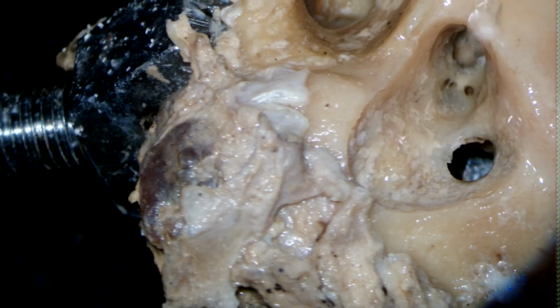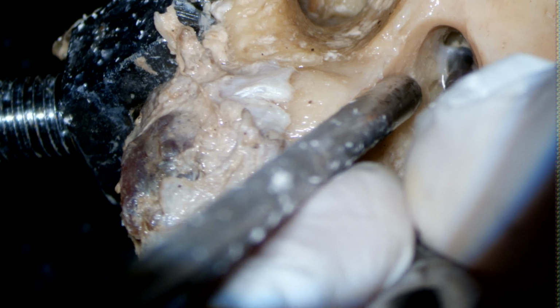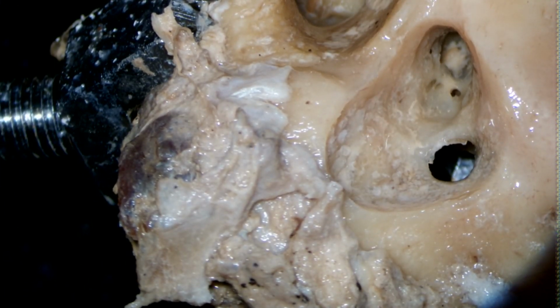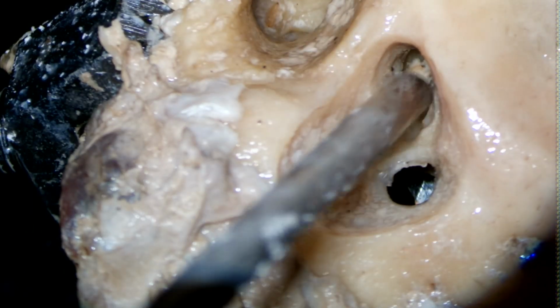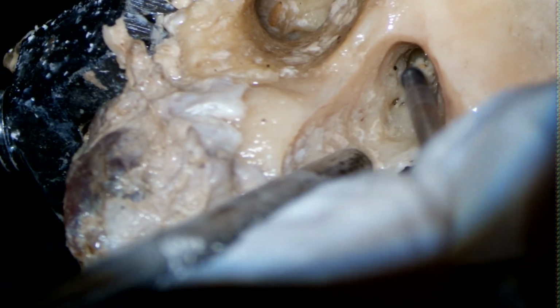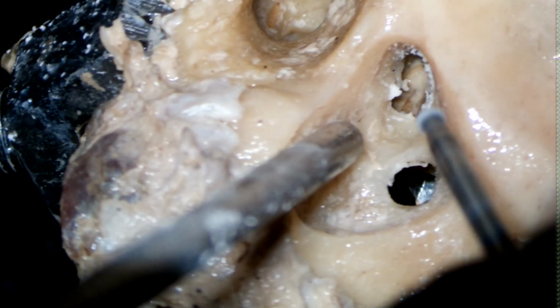Okay. I am just trying to find out. It is not going inside. So this is all we can drill. Okay, so we are now in the antrum.